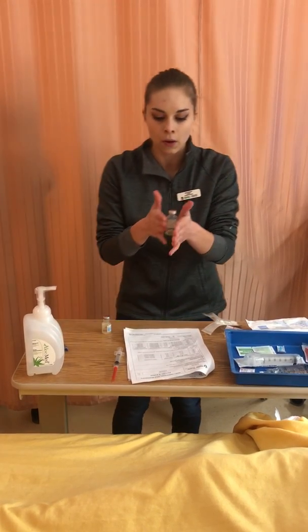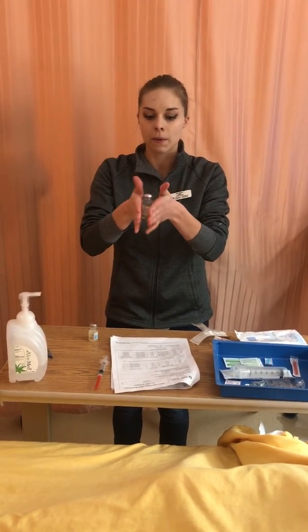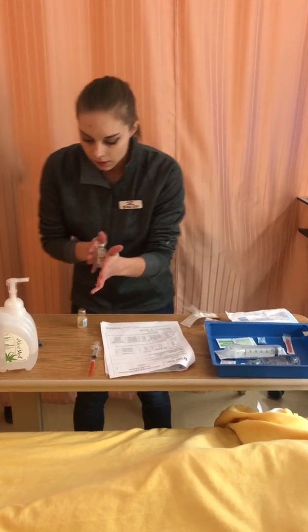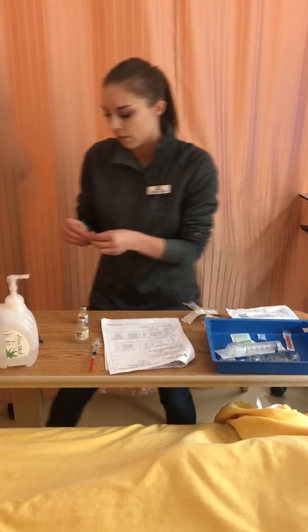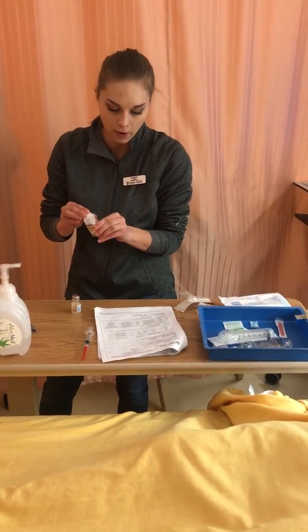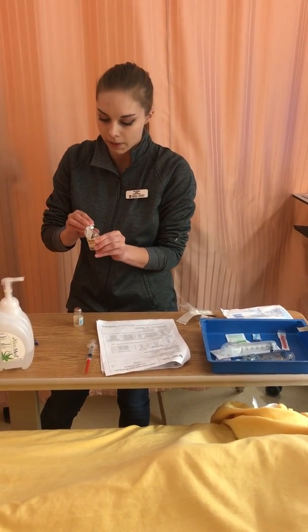And now I'm going to roll this between my hands until the medication is dissolved. It'll be about 3 to 5 minutes. I'm not shaking because I don't want to introduce air, which would create bubbles. So now it's mixed. I'm going to re-swab the top before I withdraw my medication, just because it could have been contaminated while I was reconstituting it. So for a full 30 seconds, and then I'm letting it dry completely.